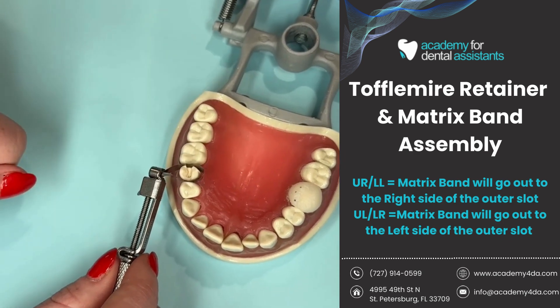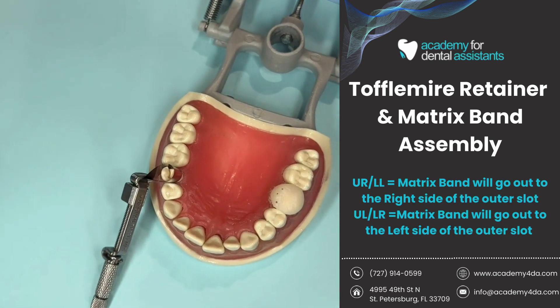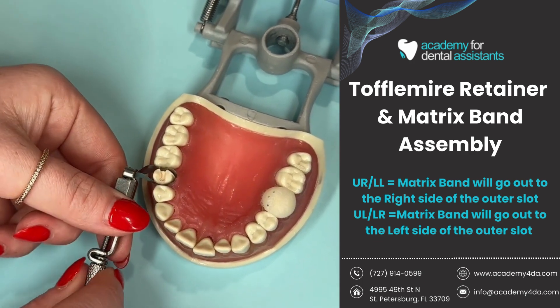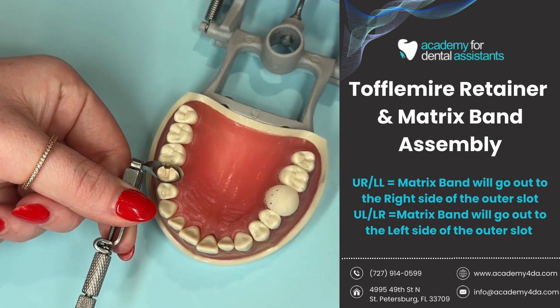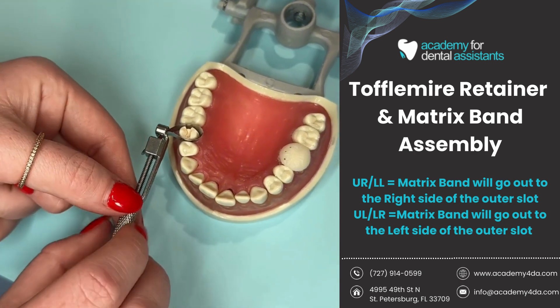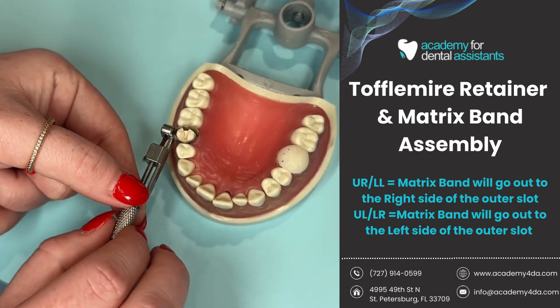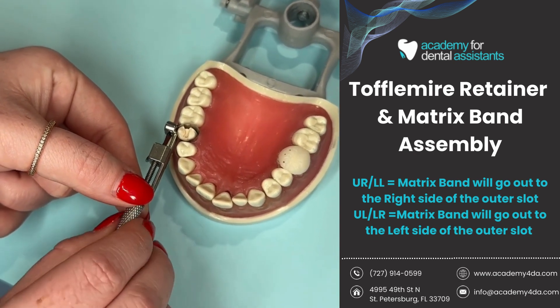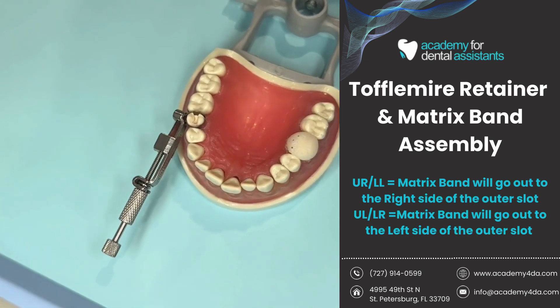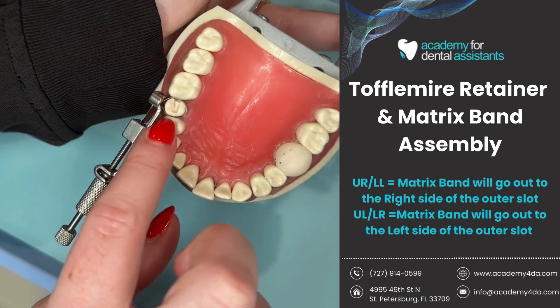Now that I have my matrix band around my tooth, I want to make sure it's nice and snug so that if I let it go, it stands up on its own. I push my finger down to make sure it's tight. Then with the inner knob — the bigger one — I turn it to the right, and you'll see that the diagonal slot begins to drop down on the spindle, which tightens around the tooth. Once it's nice and tight, I can let go and it stands up on its own, secured all around the tooth.